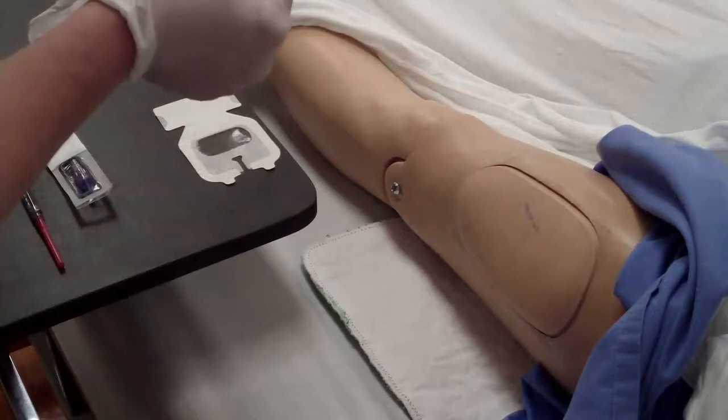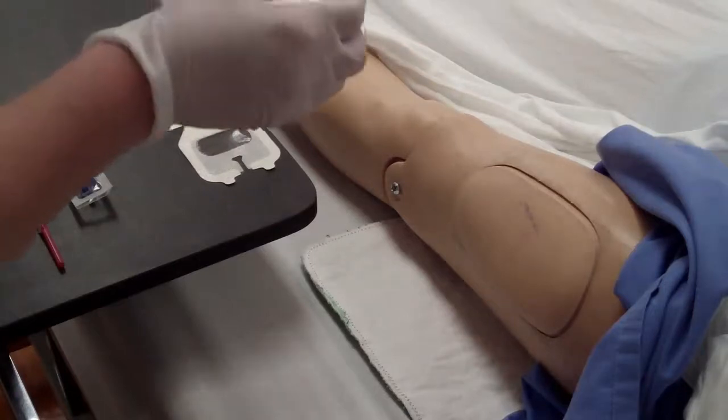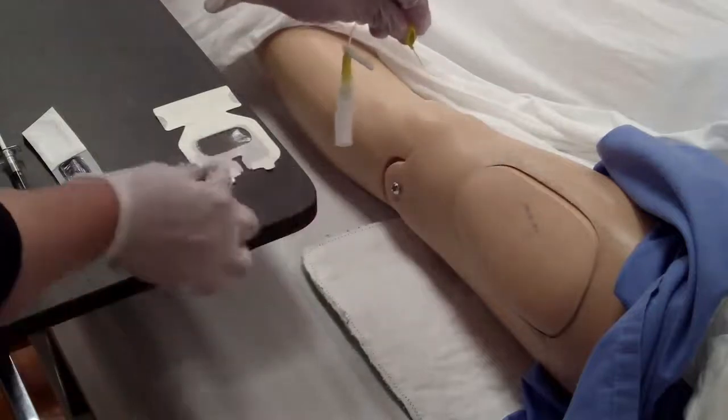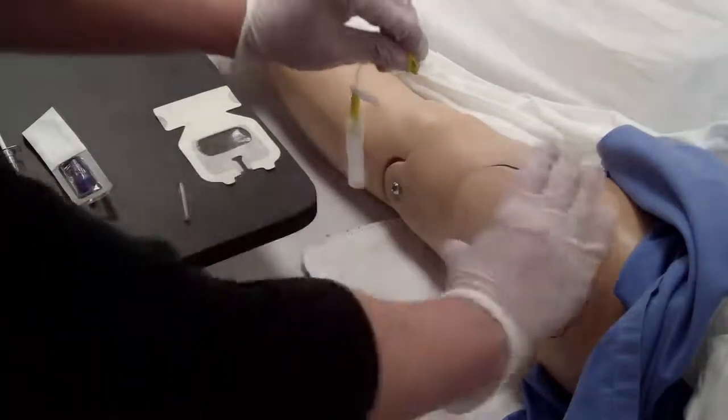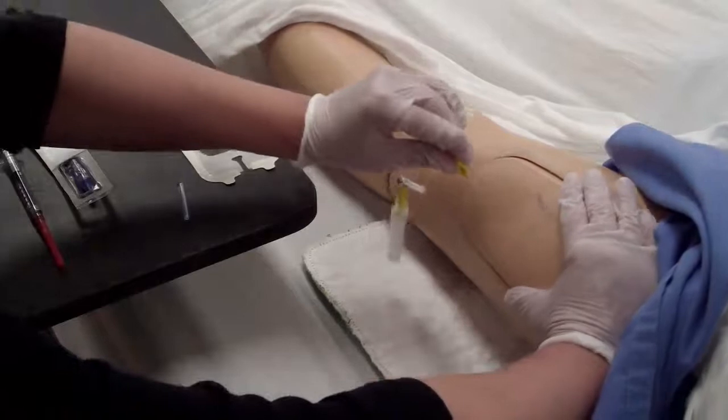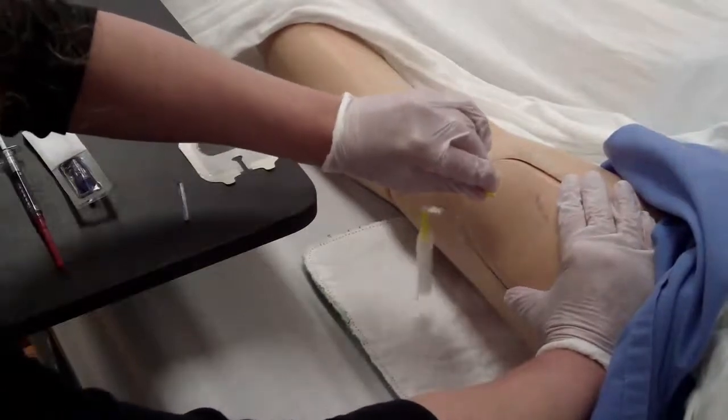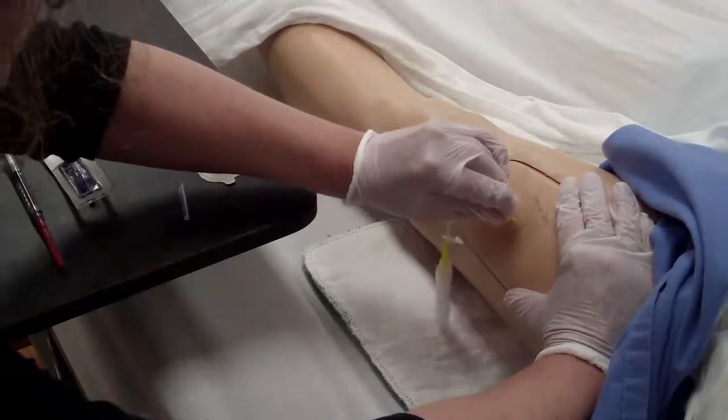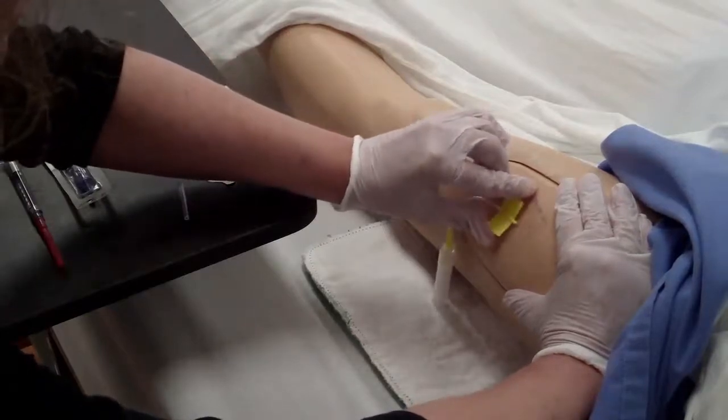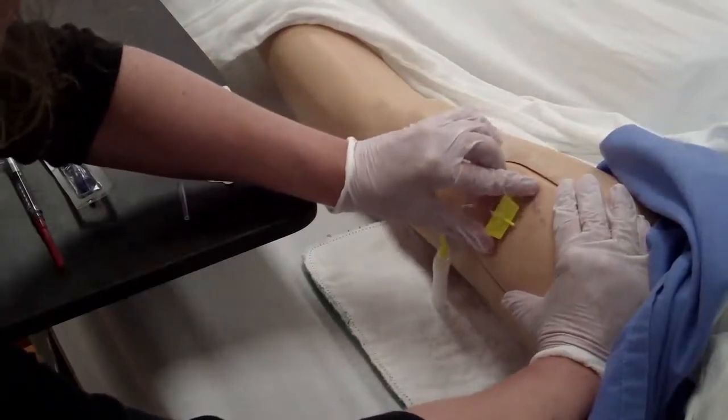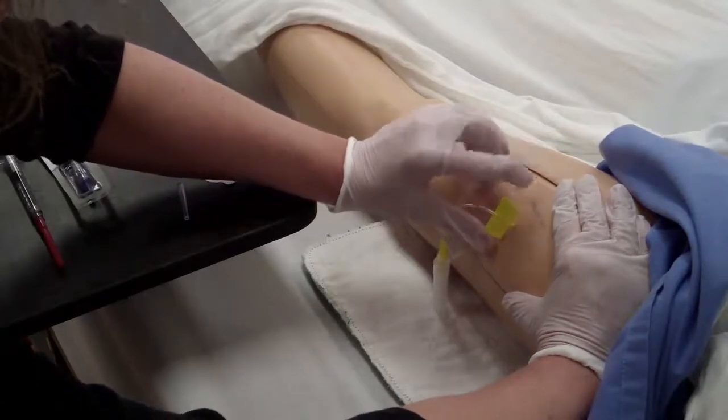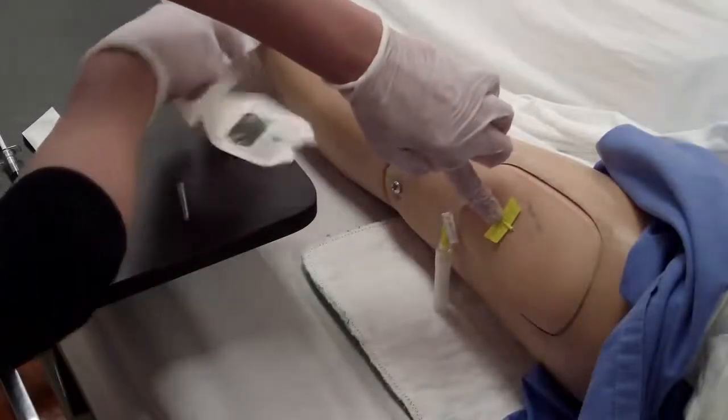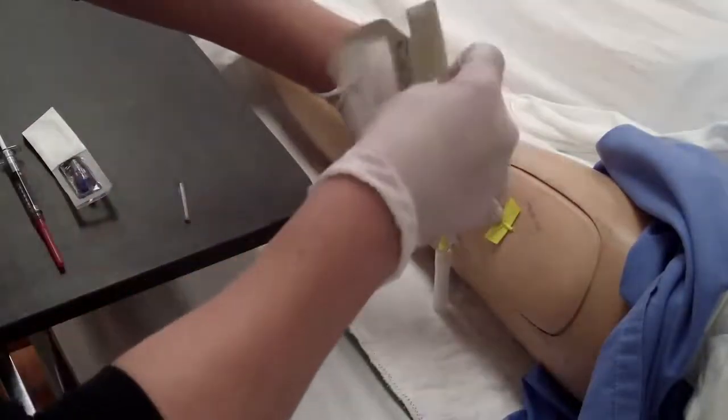With your subcutaneous butterfly, ensure that the bevel is up. Remember that the pebbled wings will be going against the client's skin. At a 30 to 45 degree angle, insert the needle firmly through the skin. Secure the catheter without touching the insertion site until the dressing is applied.